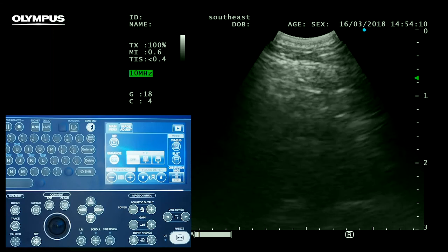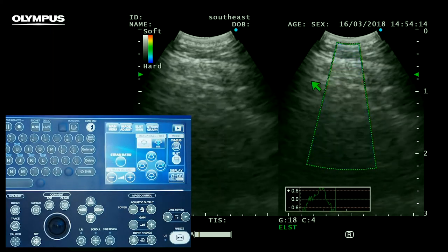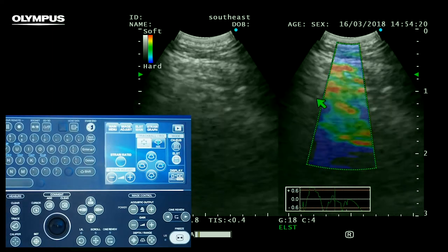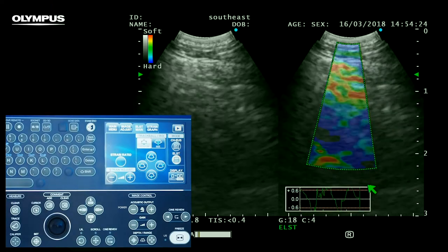Then press the ELST button to activate the elasto mode. This will bring up our split-screen mode, with the left showing our normal B-mode and the right our elasto mode, with the colour map overlay and the strain graph below.